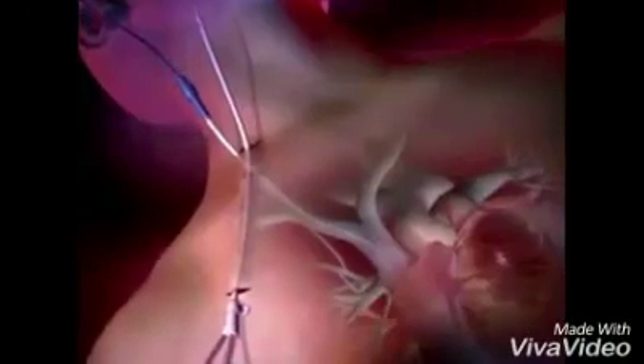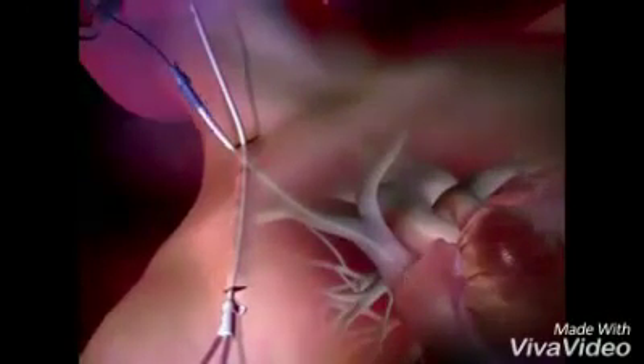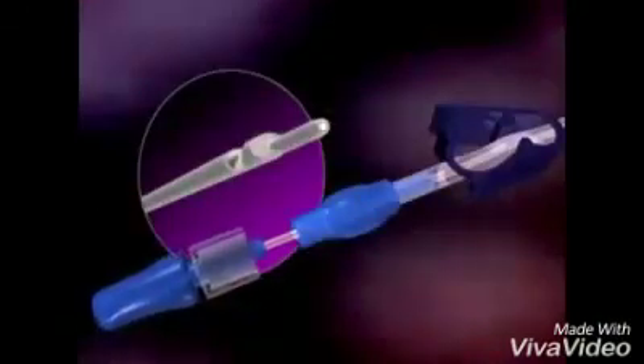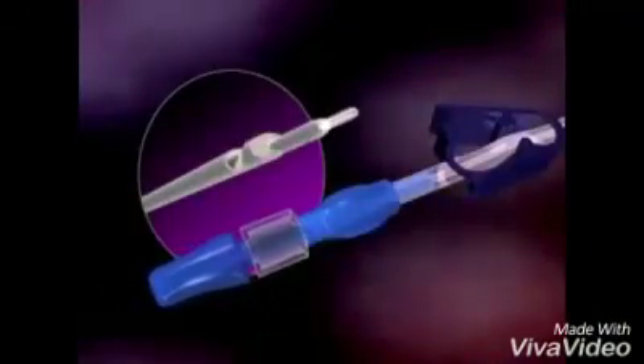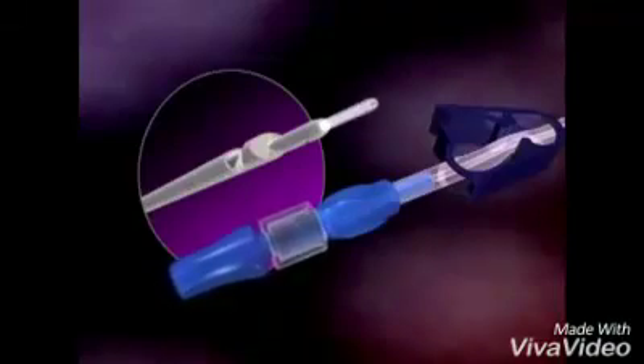Thread the dilator over the proximal end of the guide wire and advance until it is in the target vein. Remove the dilator, maintaining the guide wire's position. Advance the stylet so that it protrudes from the catheter tip. Tighten the luer lock of the stylet to the proximal end of the venous lumen and flush the stylet with saline. Thread the distal end of the stylet over the guide wire tip and advance the catheter into the target vein until the catheter is correctly positioned. Remove the stylet and guide wire from the venous lumen.